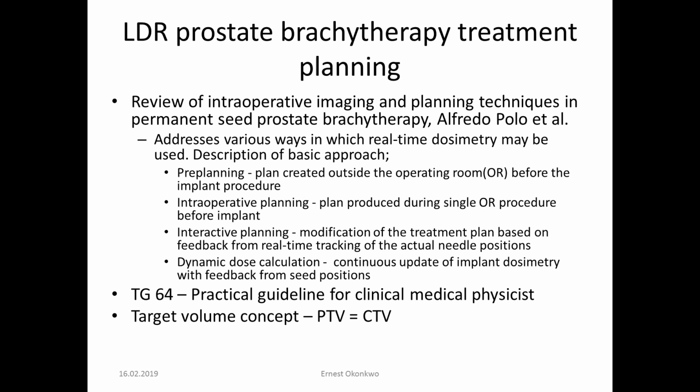Then you have the dynamic dose calculation, which I would say we are not yet there. Actually, not so many clinics are doing that, which is the continuous update of implant dosimetry with feedback from seed positions. Then you have the Task Group 64, which is the practical guideline for clinical and medical physicists.